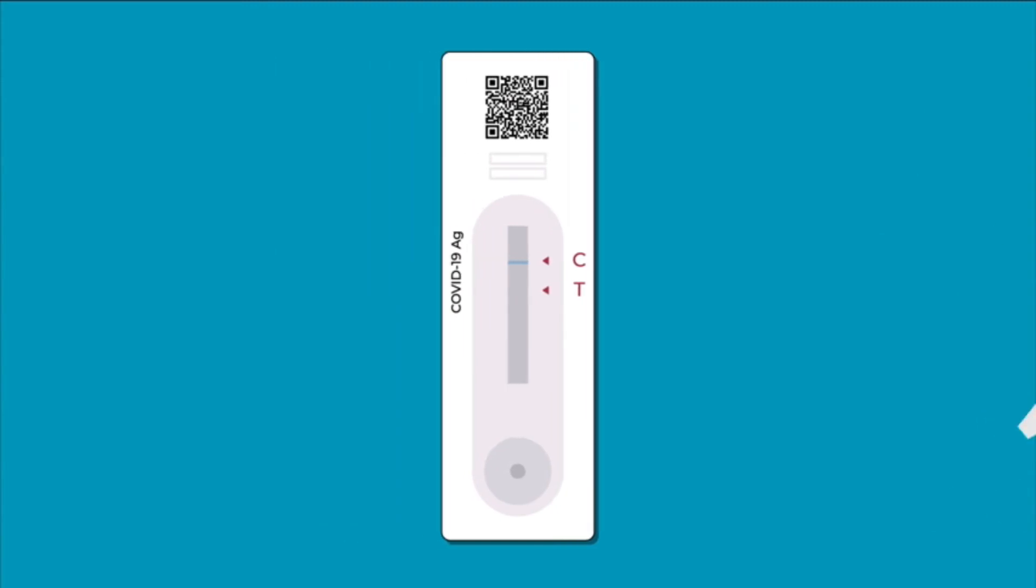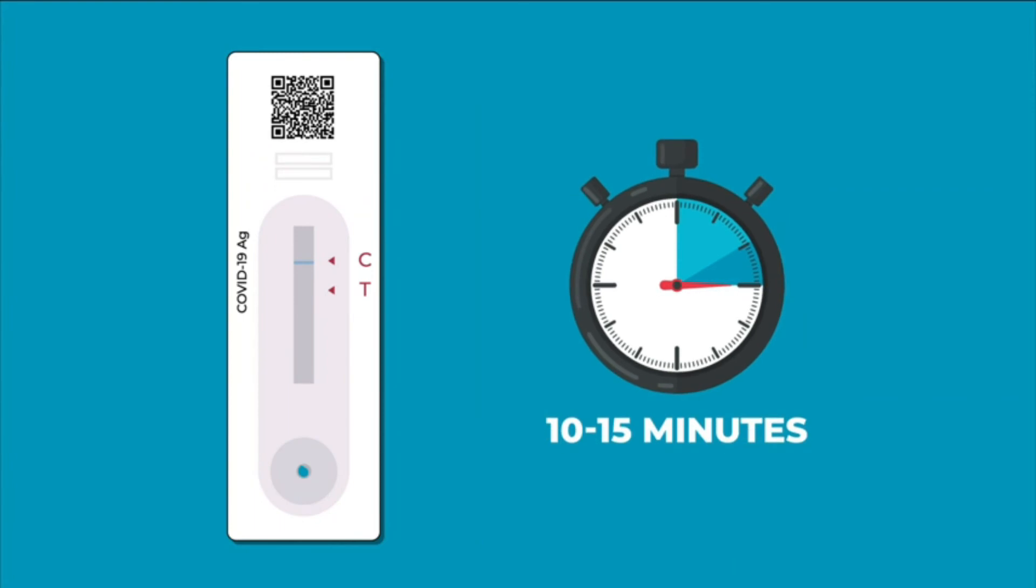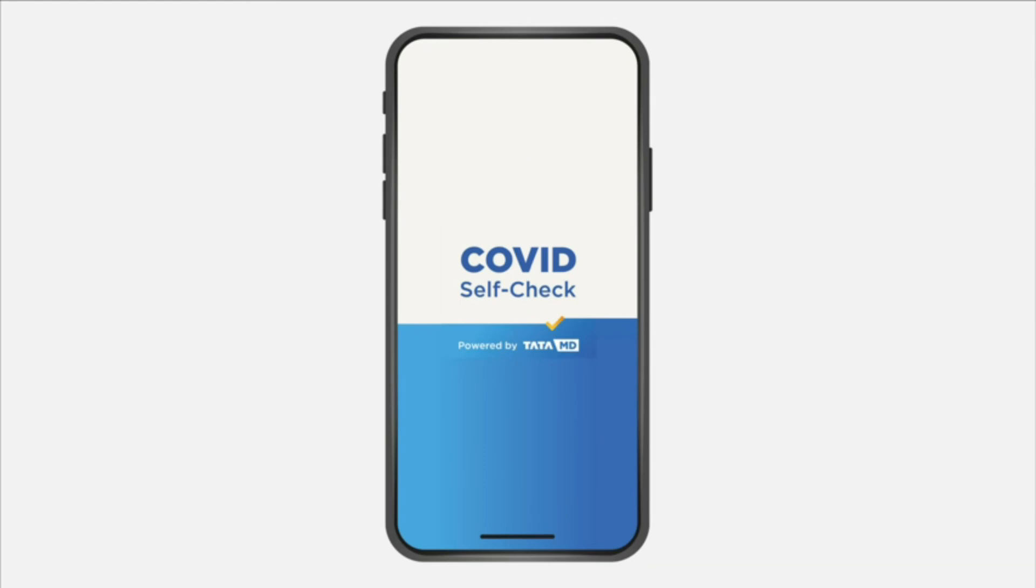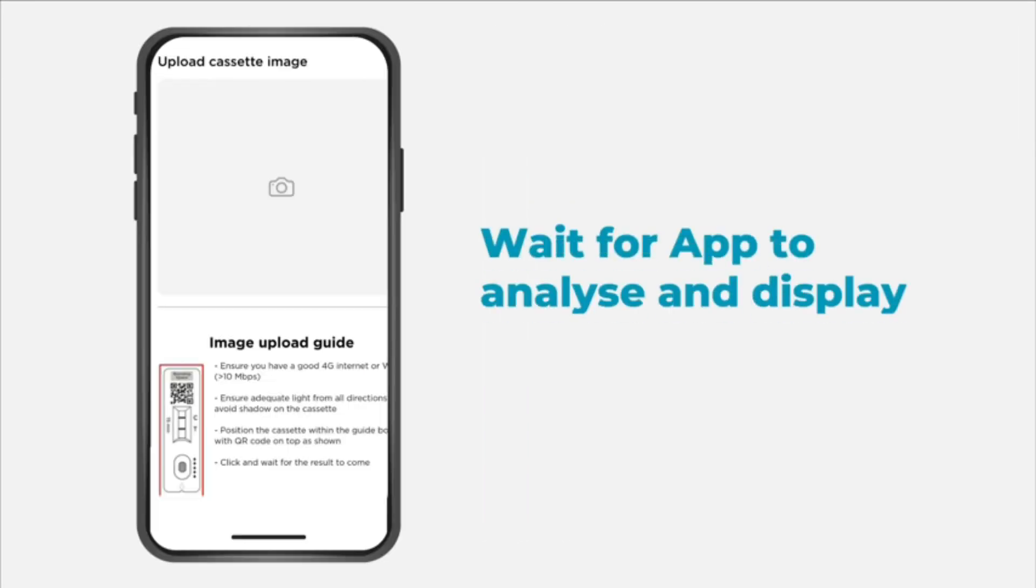In the sample well of the test cassette, add two full drops of extracted antigen buffer mixture by pressing the tube. Wait for 10 to 15 minutes for testing kit to generate results. Open the COVID Self-Check powered by TataMD app. Click picture of the testing kit. Wait for app to analyze and display test result.